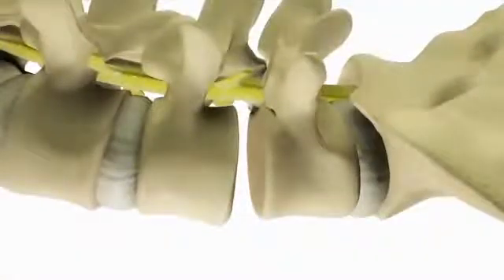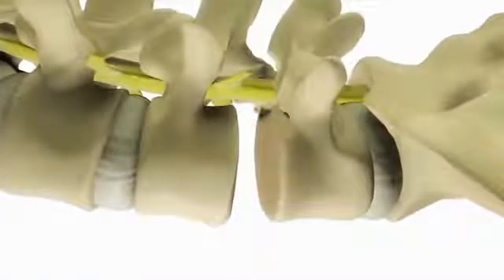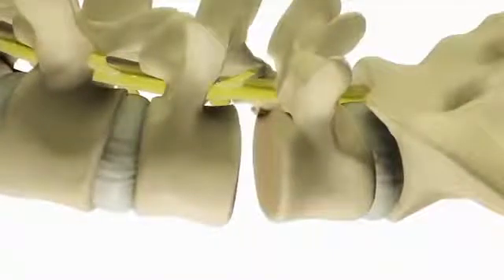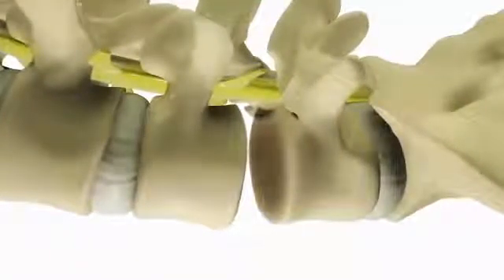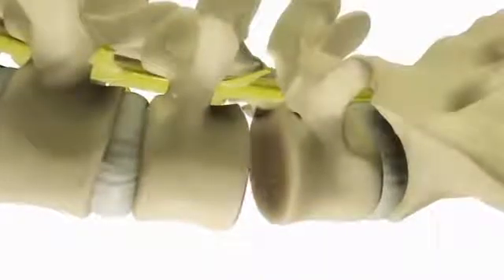If the disc has collapsed from disease, the vertebrae are moved back into a normal position. The surgeon then prepares the area where the disc was removed so that the spinal implant can be placed for support.